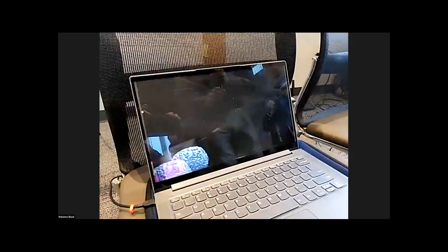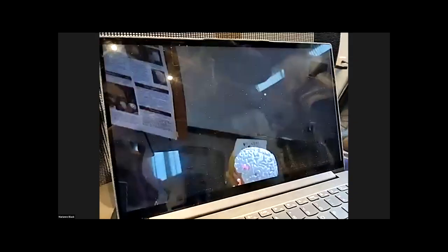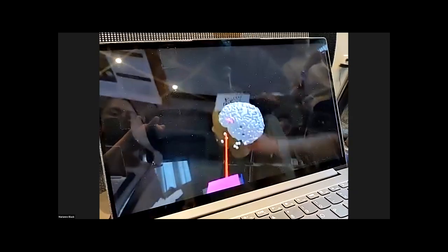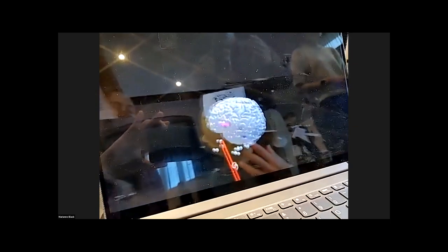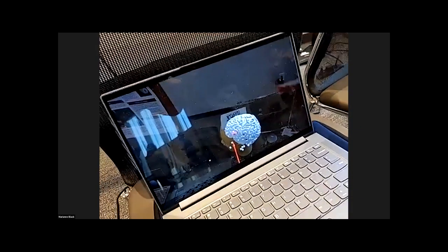So right here, normally there's usually a registration procedure. What people do is you might see all those different spheres. A person normally uses a registration procedure to put all of those spheres on different landmarks of the person's head. If we have a virtual model of a patient's head, we can align those points that we put on a person's head to this virtual model, which then allows us to put a virtual model of the brain on top of their real head. That's the step that's past this point. In this part of the project, you can see they've already registered the brain to the head.